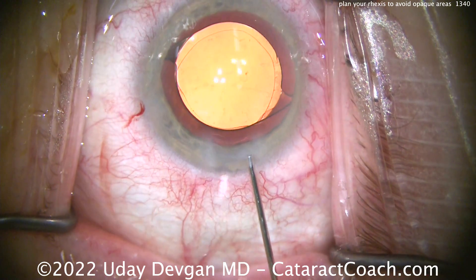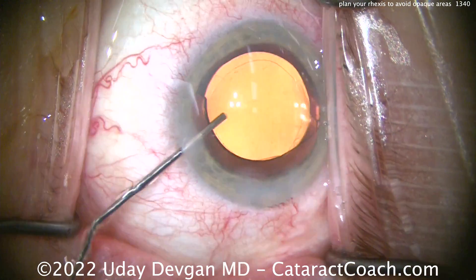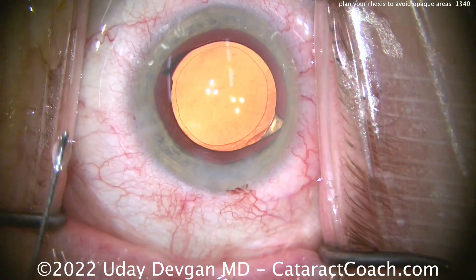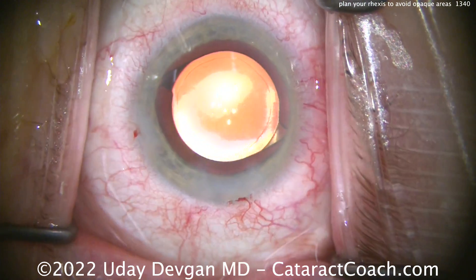Let's hydrate this incision and get that AC deepened. You can see there's a little bit of a catch of the optic edge on that rhexis, so we're going to go in and make it just right — we won't leave it like that. Now centering up that lens. There it is — look at that overlap. That's a really good 360-degree overlap. Patients are going to have a very nice outcome from this.